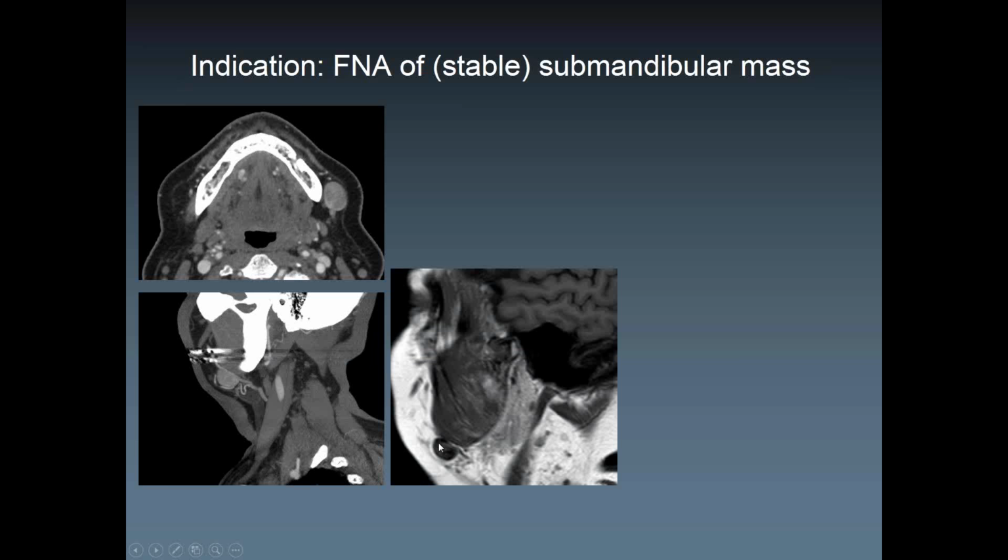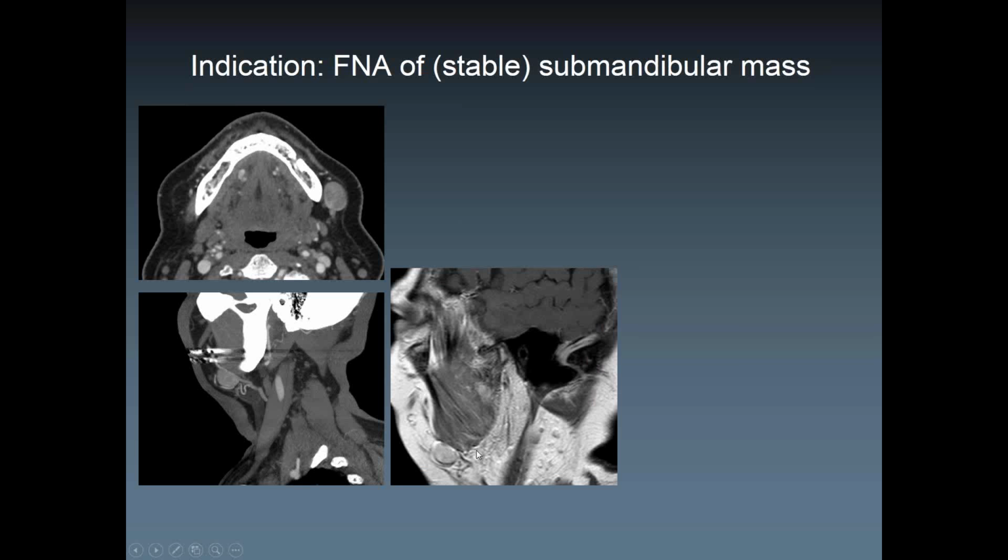And on MRT1, it looks like this without contrast. It's a mildly indeterminate, intermediate intensity lesion here. And then with contrast, it kind of fills in, right? Or shows enhancement.